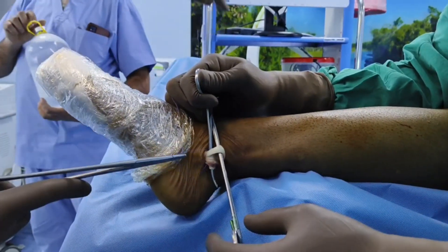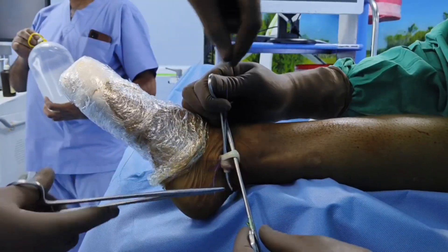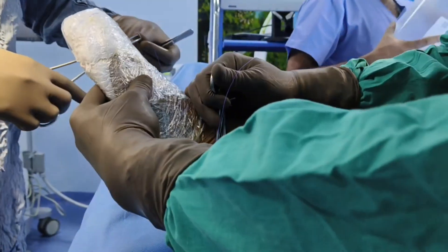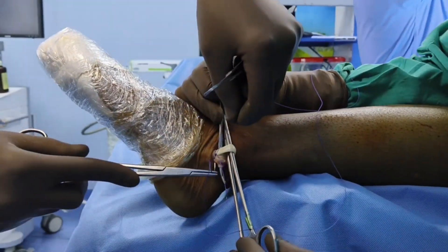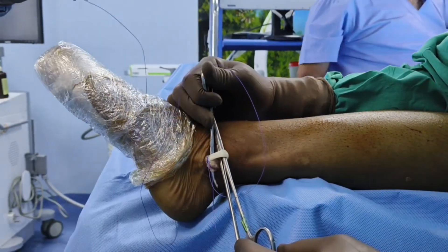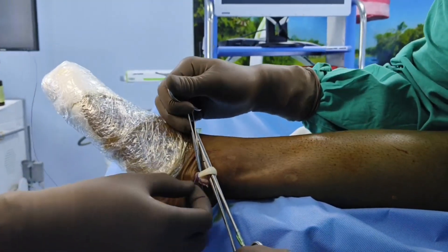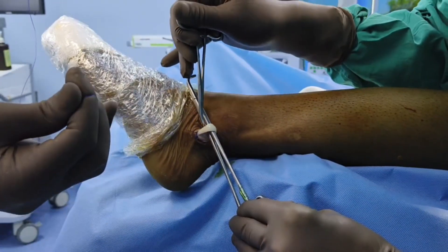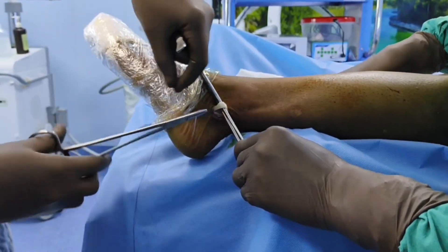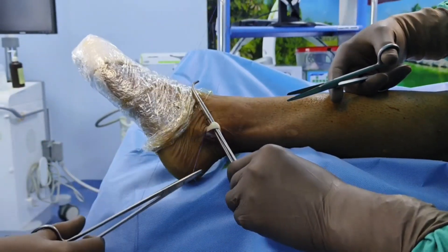The next step is to evert the foot and tie both tendons together with the help of a Vicryl suture — any absorbable suture can be used. You tie these two tendons at the distal end of the wound. This will have a tenodesis effect so that when you harvest the peroneus longus tendon, the peroneus brevis will function distally and the ankle function will not be compromised.